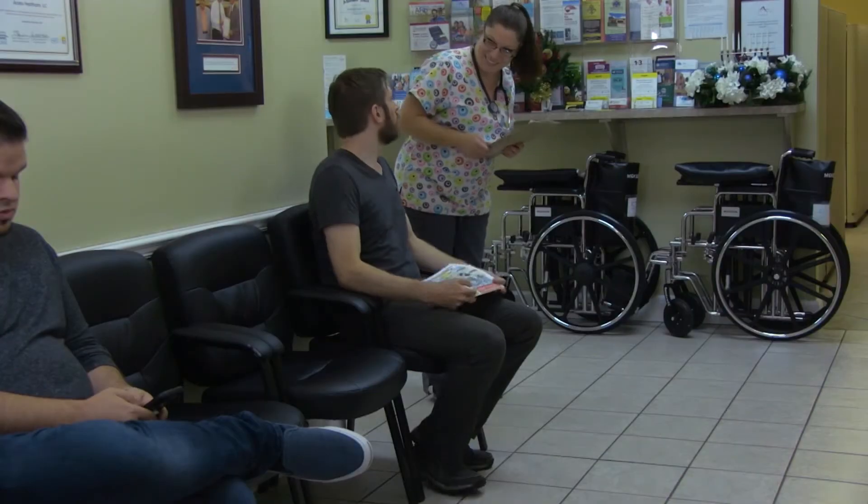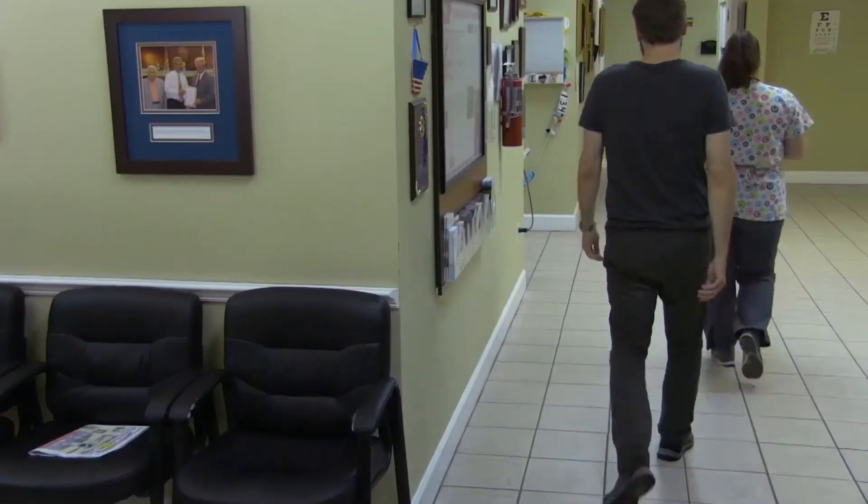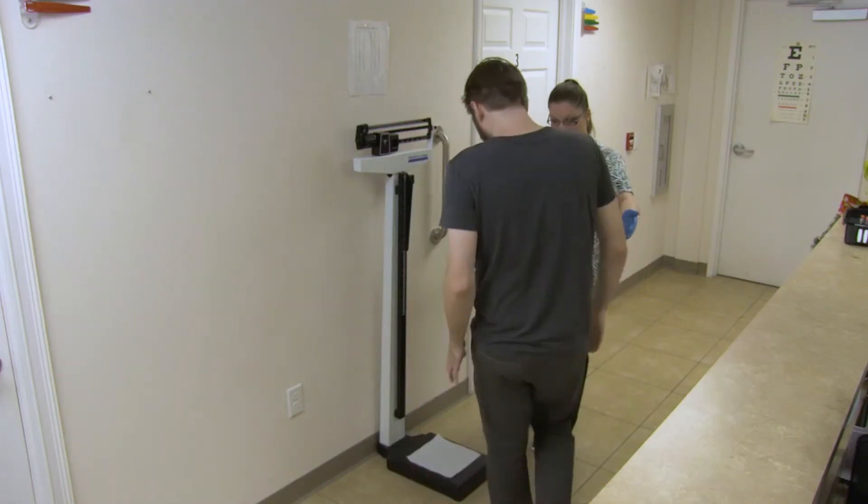Vital signs: measuring weight. Introduce yourself and explain the procedure to the patient while identifying that you have the correct patient. Place a paper towel on the scale, zero the balance beam or digital scale, and assist them onto the scale.